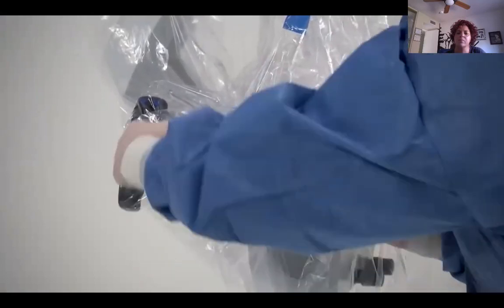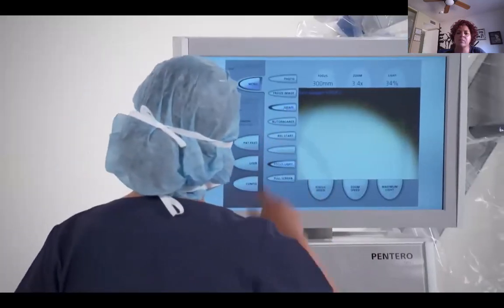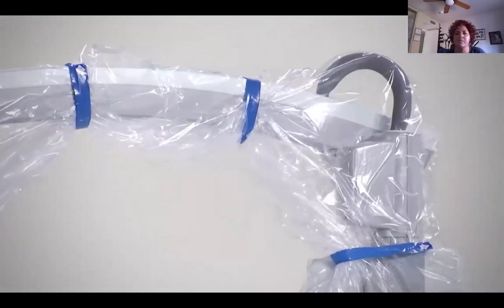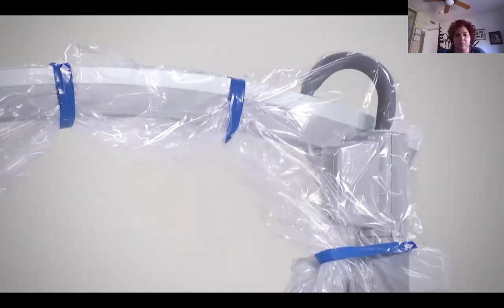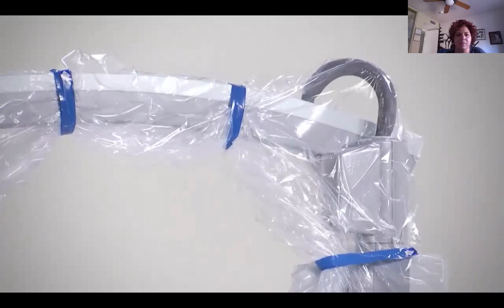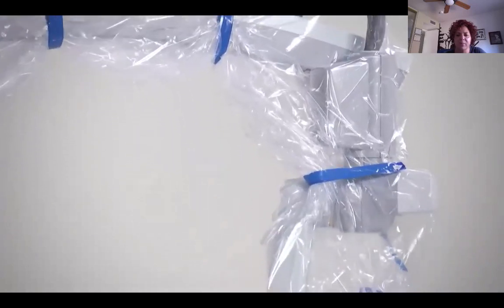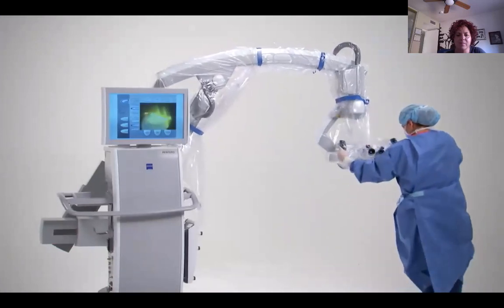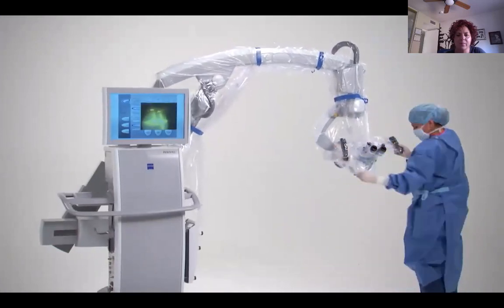If the microscope is equipped with auto drape, press the drape button in the main menu. This activates the pump. The pump system increases to maximum power for 2 minutes to extract the air from under the drape, and then switches to a lower speed to maintain air levels. Once the drape has been secured, check to ensure for ease of movement of all controls.